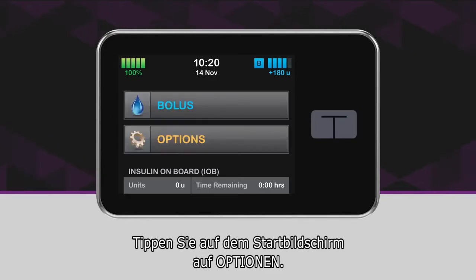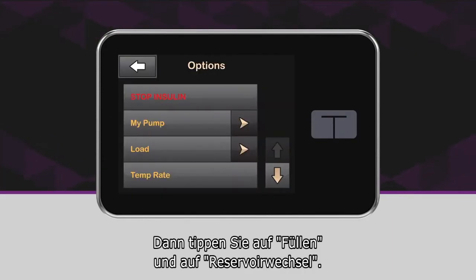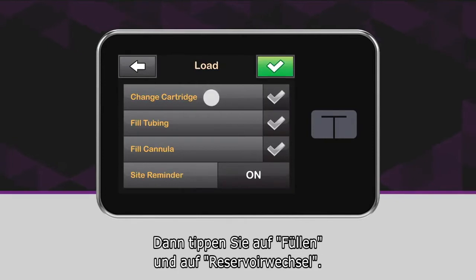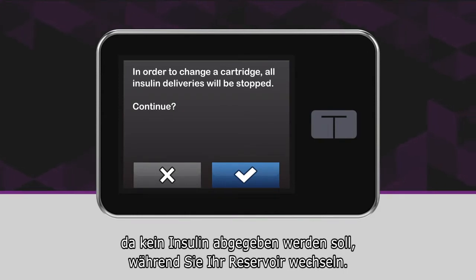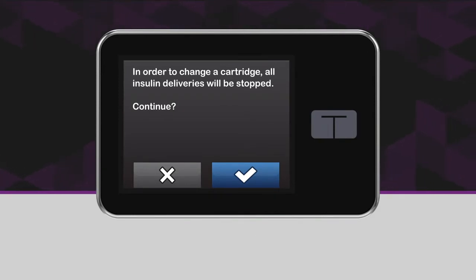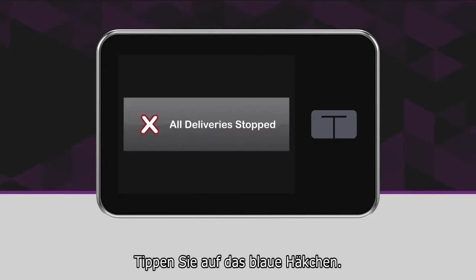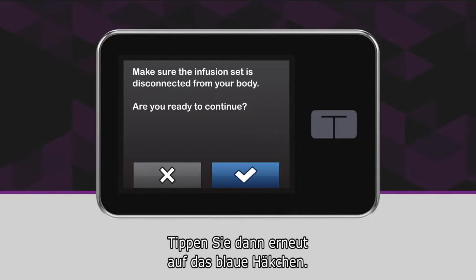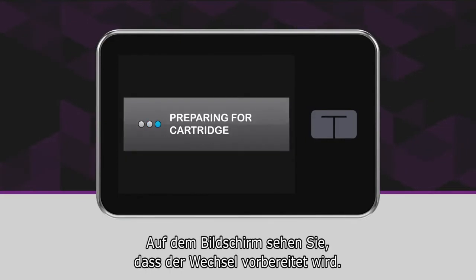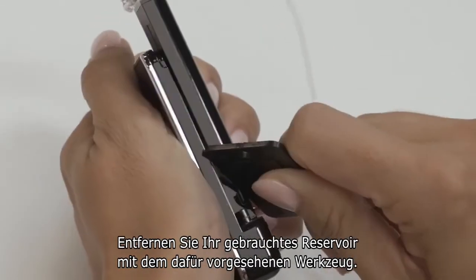Now turn on and unlock your pump. From the home screen, tap Options, then tap Load, then tap Change Cartridge. The pump will tell you that all deliveries will be stopped, which is fine since you don't want to be trying to pump while you're changing your cartridge, so tap the check mark to continue. Next, you'll be prompted to disconnect your infusion set from your body — tap the check mark to continue.